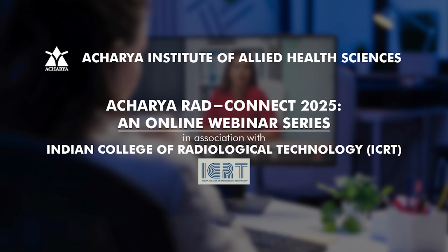There is this question about the possibility of using a physical computer and VR simulated combination. That is what hybrid simulation is all about. You'll have your physical models that can be connected to different computer systems as well as your VR simulation, so that you can catheterize on the physical model and that can be visualized on your VR headset. So it is possible to combine all these.